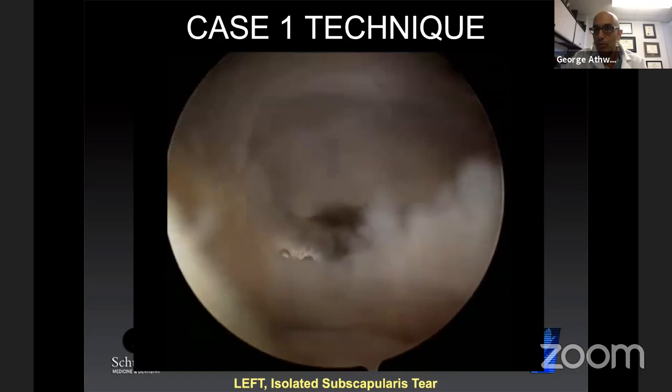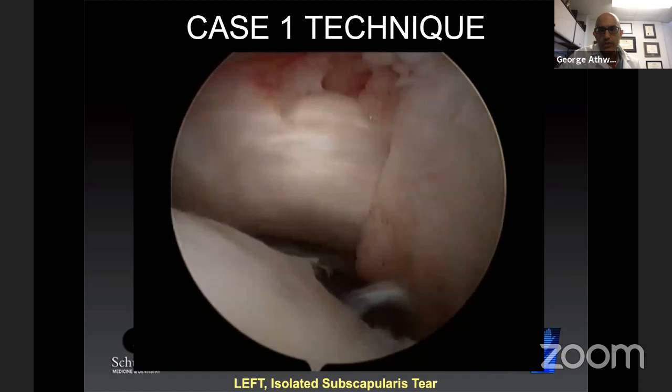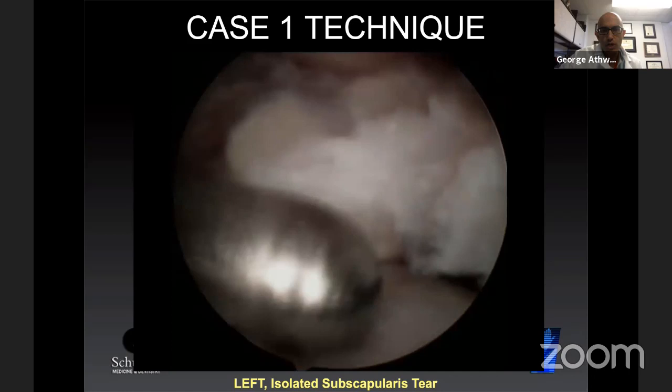So we're going to go ahead and debride. Here are the remnants of the coracohumeral ligament, and I'm going to give this a pull. As I pull it, you see the rolled upper border of subscapularis right there. That edge has to be attached to the upper aspect of the lesser tuberosity. If we look down, this is a complete full thickness subscap tear. There's no tissue attached to the lesser tuberosity.